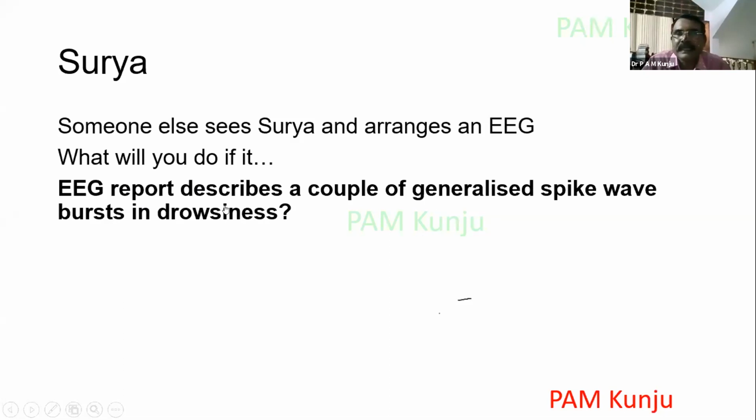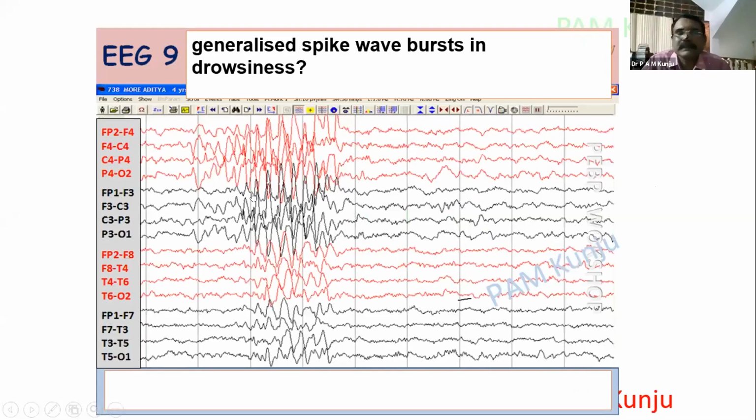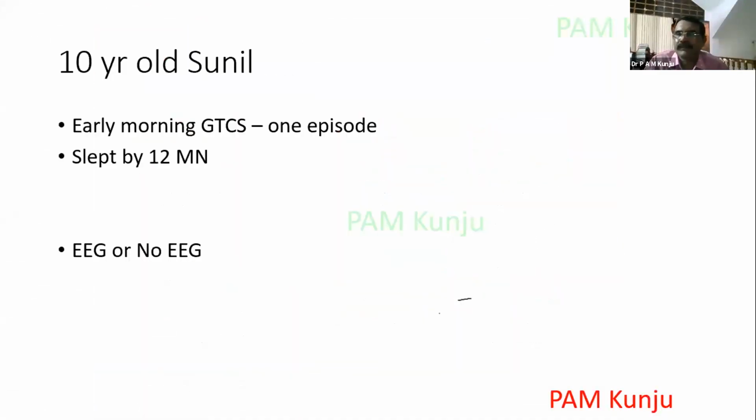Just see the EEG. Here again, you must understand that C4, P4, these are all vertex waves. C4, central vertex, again C3. So it's mainly arising from the vertex area, and this is what is called a hypnic burst or a hypnagogic hypersynchrony. Again, it is a normal one. That means our history, our diagnosis of the reflex anoxic seizure or syncope stands. So there was no need for any EEG.